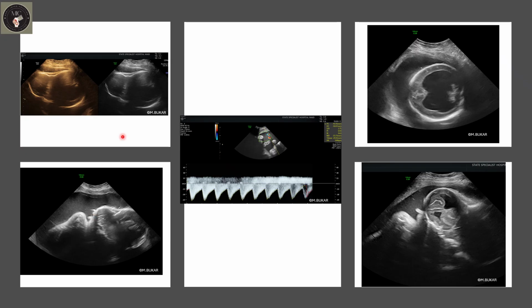So let's look at the still images. You can see the bulge here towards the pinna here, the ventriculomegaly, destruction of the septum pellucidum, dilated anterior horns. But look at the umbilical artery loop, apparently normal, but this is not a placental pathology.